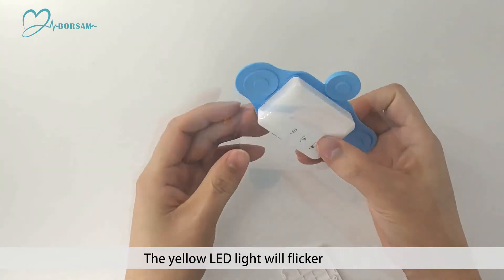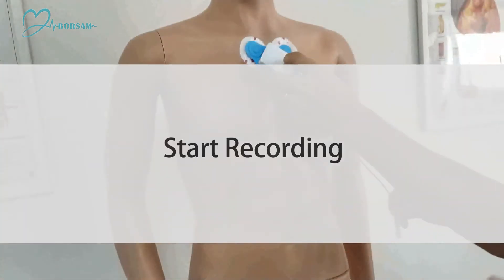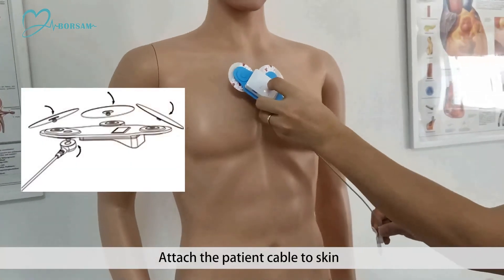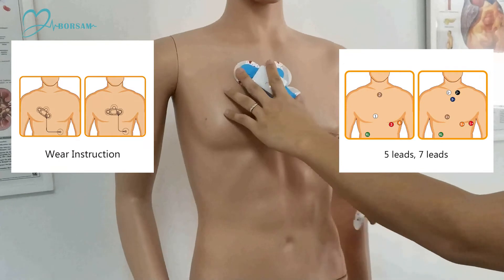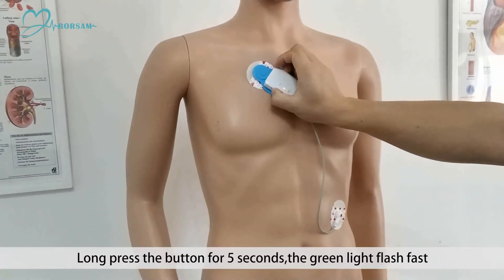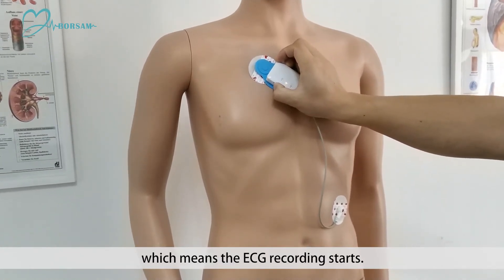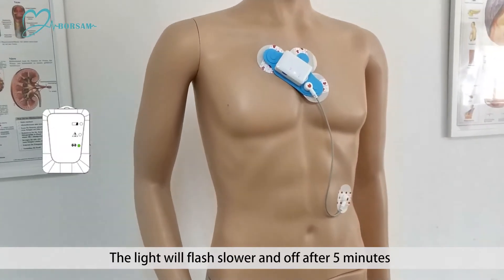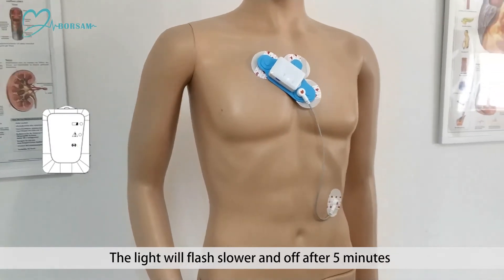The yellow LED light will flicker — start recording. Attach the patient cable to skin. Long press the button for 5 seconds; the green light flashes fast, which means the ECG recording starts. The light will flash slower and end off after 5 minutes.